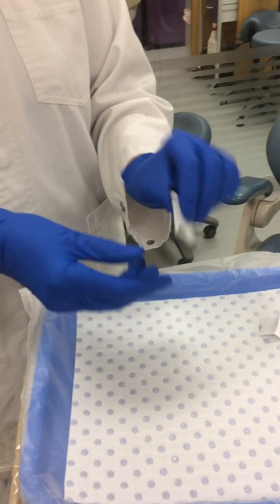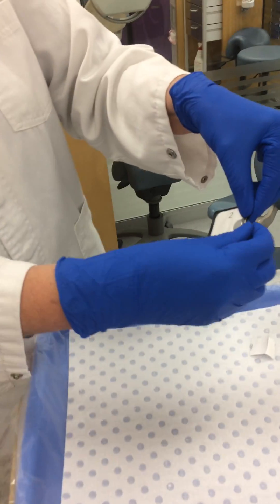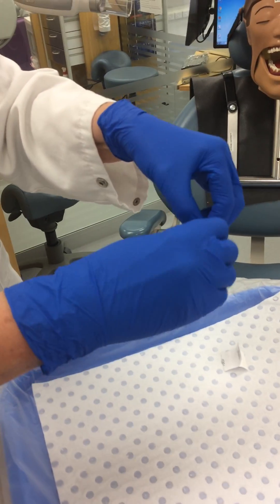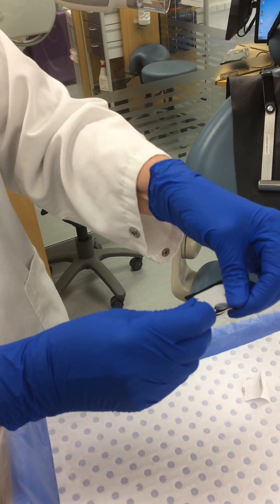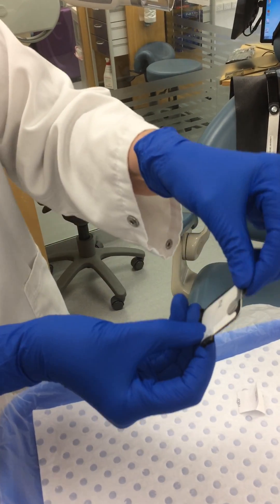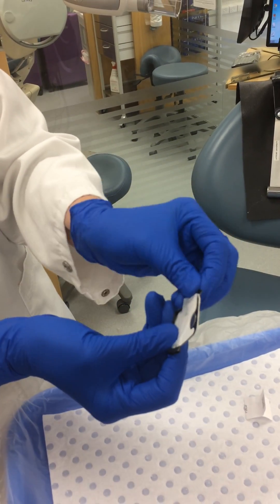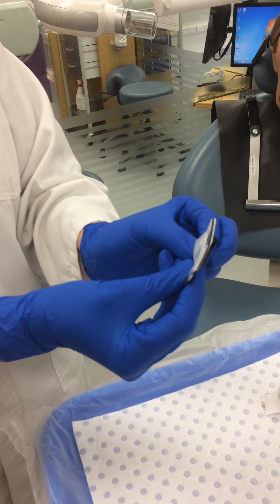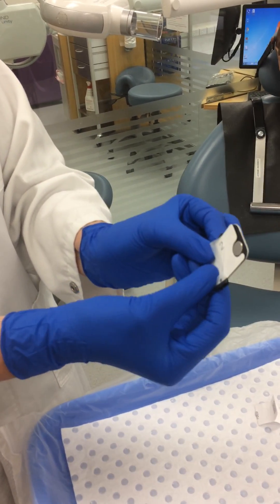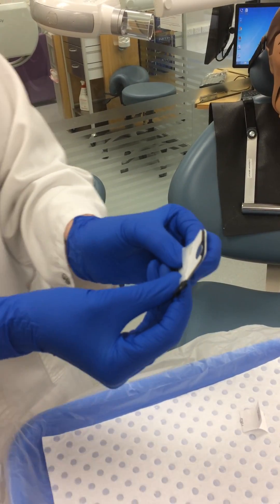You take off the tab and then carefully open — there's a little slot here that shows you that you need to pull and bring across like that. You slide it down either side, remembering this plastic coating will be covered in saliva. You need to be very careful that your hands don't touch the phosphor plate.